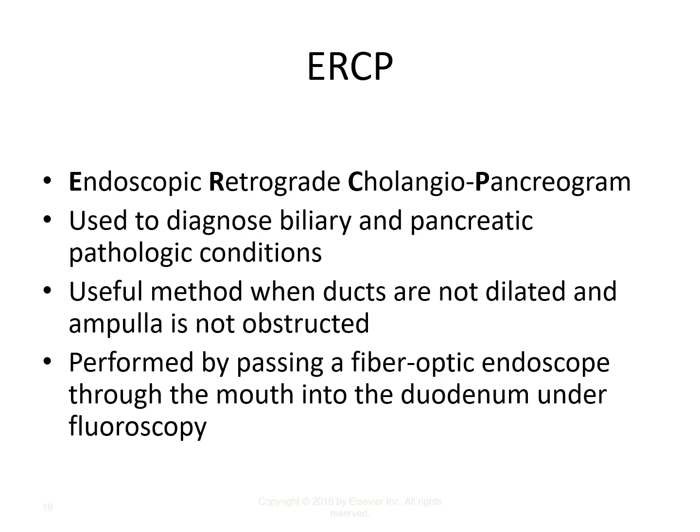Now, what did retrograde mean back when we covered urography and cystography? Oh, yeah, that means the contrast is introduced opposite from the normal physiological flow of the system. Well, does that make sense here? Yeah, because bile is supposed to come from the liver and flow down and exit into the small bowel. But that's not the way we're injecting contrast. We're injecting contrast from the small bowel back up into the biliary tree toward the liver. So that explains the use of the term retrograde. Okay.